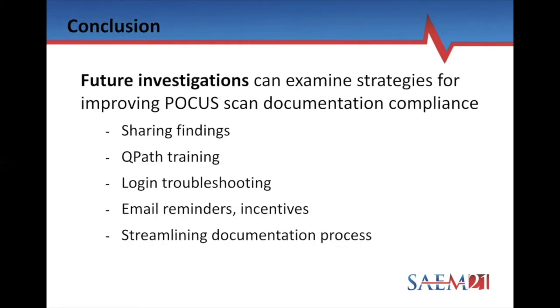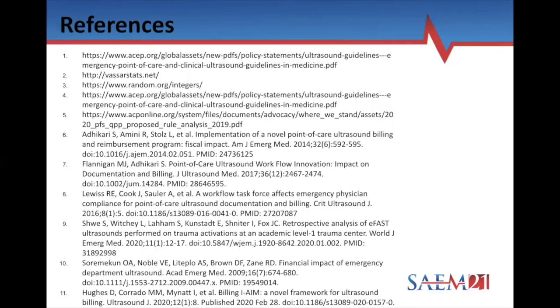In the future, some things that we can look at that other studies have also looked at to improve ultrasound documentation compliance, including sharing the findings from the study so that all the staff are aware, training the staff in the software more frequently, troubleshooting any login issues, lengthening logout time so you're not signing in again and again on a busy shift, sending out email reminders, providing incentives for higher performing faculty, and streamlining the documentation process. So if there's a way to perform the scan, interpret it, sign it, and transmit it all in one place instead of going back to your computer and performing all these extra unnecessary steps, it might help with compliance as well. These are my references.